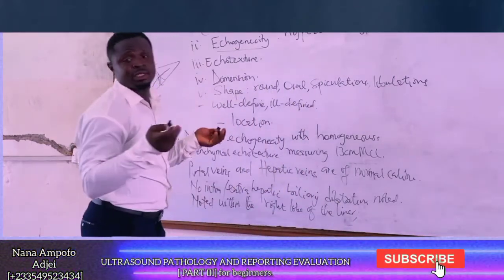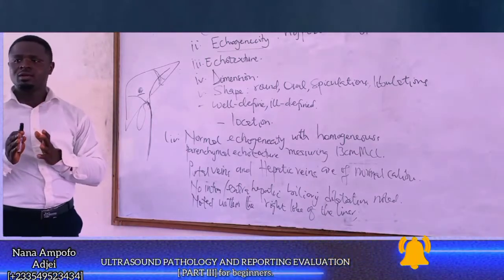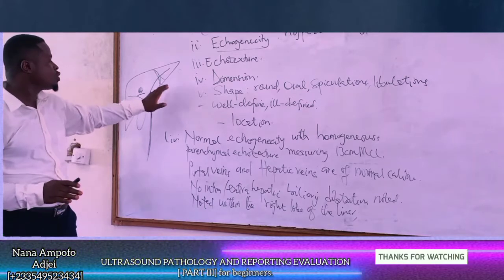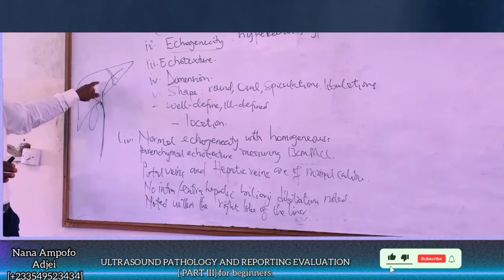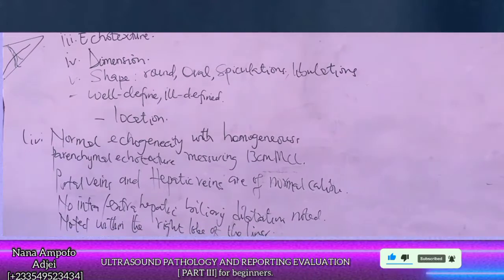What are you seeing? It is what you are actually seeing on the sonogram, not what you call someone to confirm, because ultrasound is operator dependent. It is based on what you are seeing.